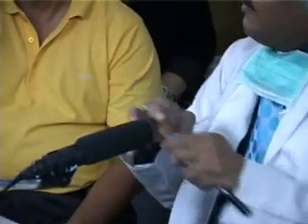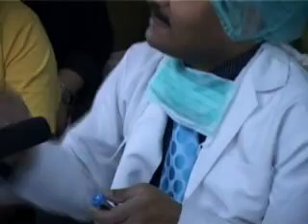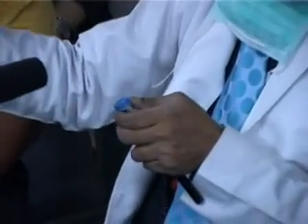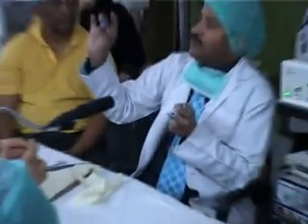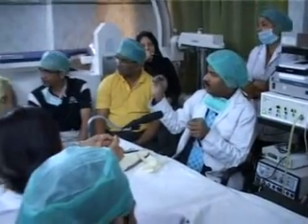Now it will not leak, because it is making an artificial diaphragm here. And even if you put your instrument, at least that surgery you can continue. It will not leak. And later you can change it. So this way. When we give suction irrigation, we are sucking out the gas also.